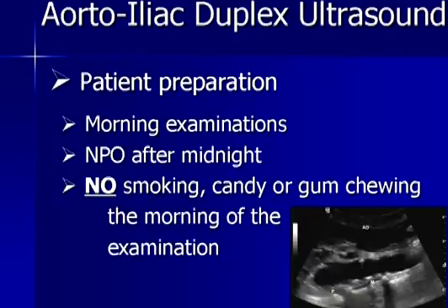On the way into having the study performed, particularly in the outpatient setting, perhaps the most important instruction you're going to give the patient is no smoking, no hard candy, or no gum chewing prior to coming in for the examination, as any of these activities, while the patient may not view them as eating or drinking, certainly will allow a large amount of gas to be ingested into the GI system and will interfere significantly with your ability to obtain a high-quality study.